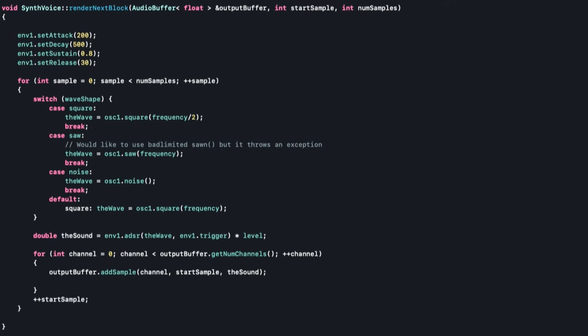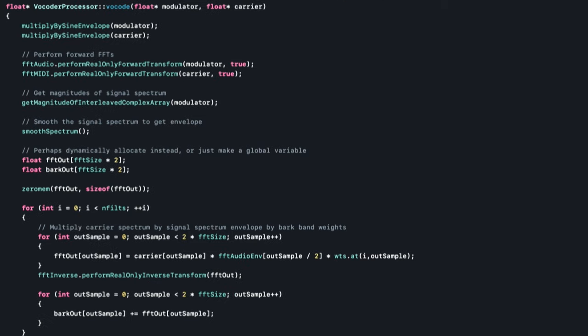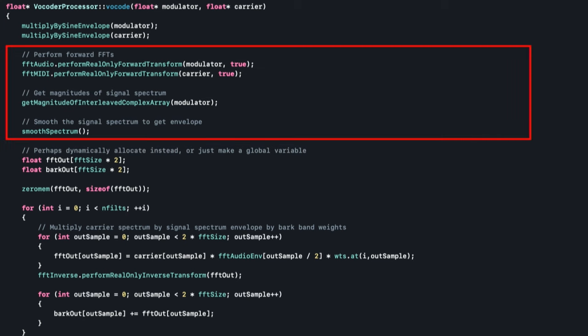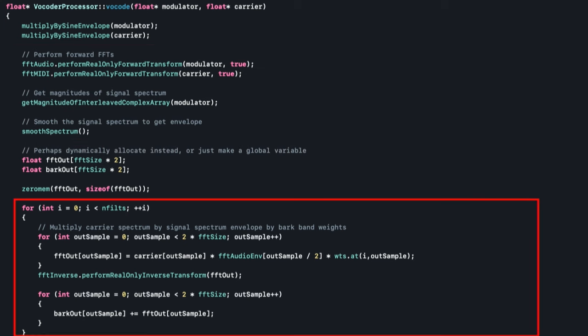Inside the SynthVoice class, which is responsible for synthesis of the carrier waveforms, the most important part is the renderNextBlock method, which gets overridden. It handles the generation of different waveforms using the frequency received from the MIDI note number, as well as start and stop note triggers for driving an ADSR envelope multiplied with the carrier waveform. Rather than showing the processBlock of the plugin, the vocode method itself implements the actual vocoder processing: the FFTs of both modulator and carrier are calculated, the magnitude of the modulator is computed and smoothed by averaging, and a for loop multiplies the carrier with the smoothed envelope extracted from the modulator across all filter bands.